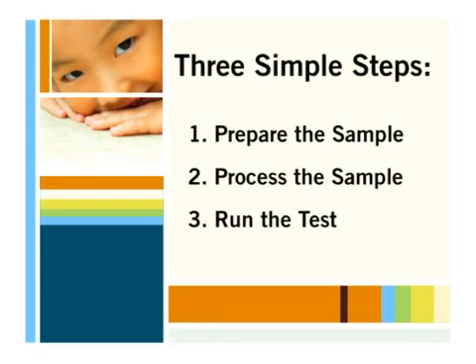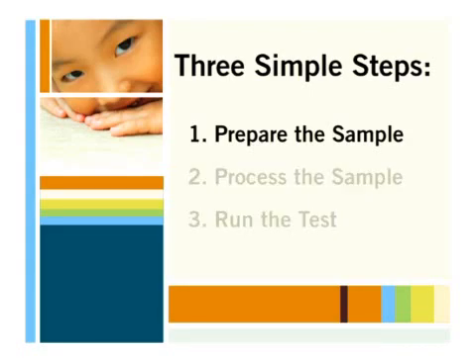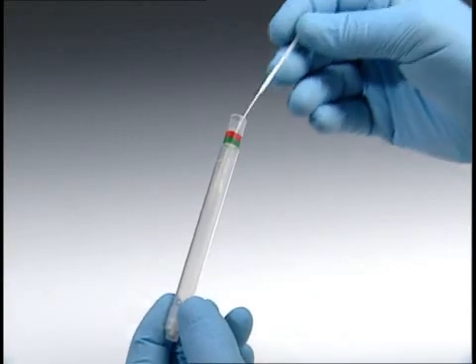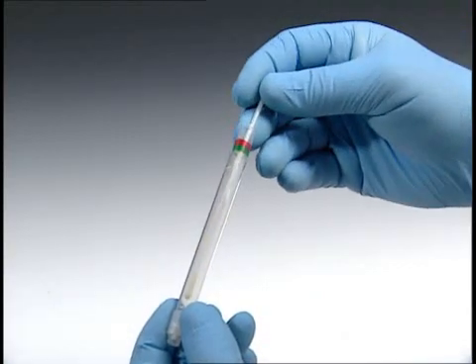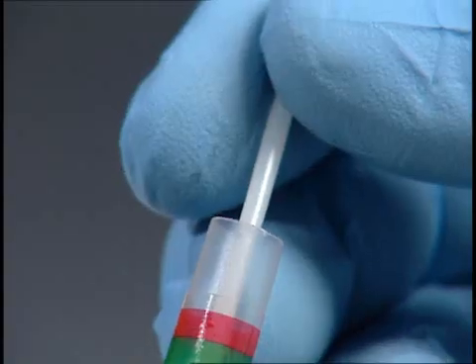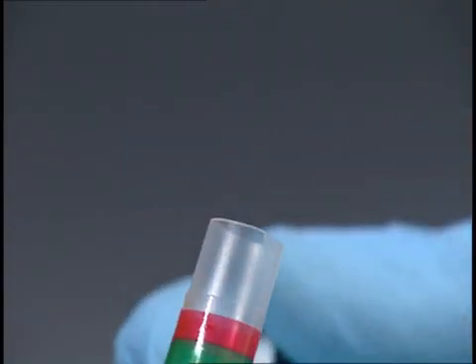Results are obtained in just three simple steps. First, prepare the sample. Insert the specimen swab into the reagent tube and break off the handle.